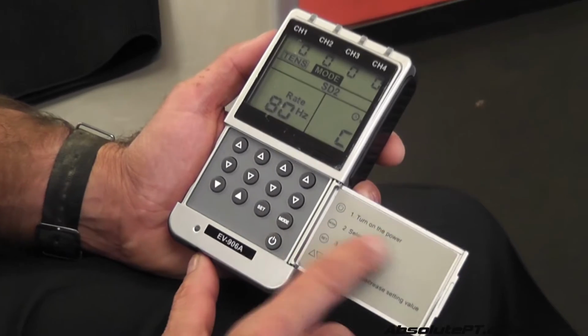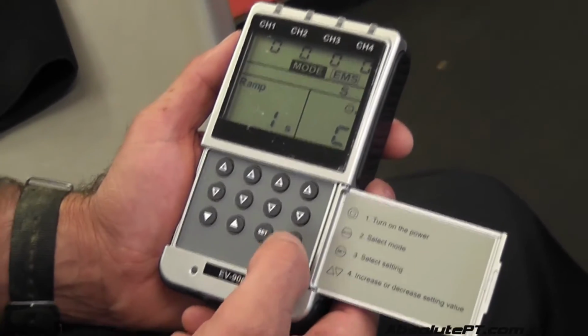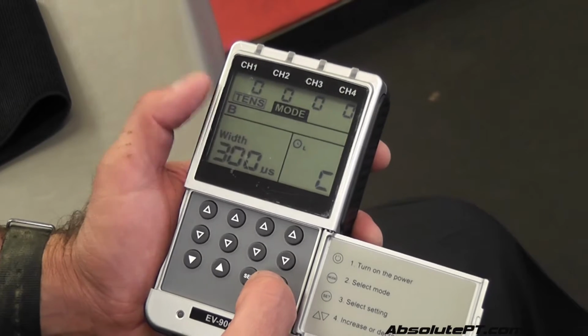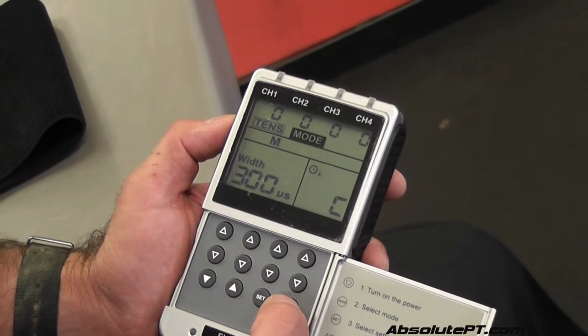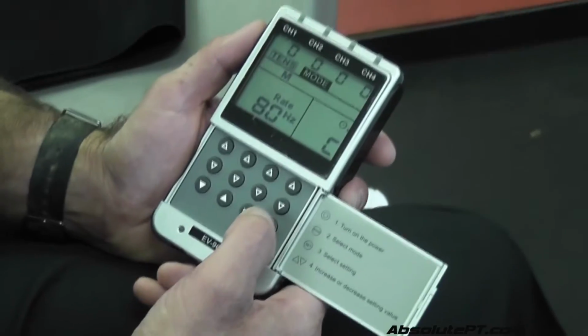You would turn on the power, select the mode. So the mode I use to work out or to train people is S. So you push through the mode button and it brings you through B, which I almost never use, N, which I almost never use, M, which is not a bad little modulatory pain thing, feels pretty good. I wouldn't use it to strengthen.